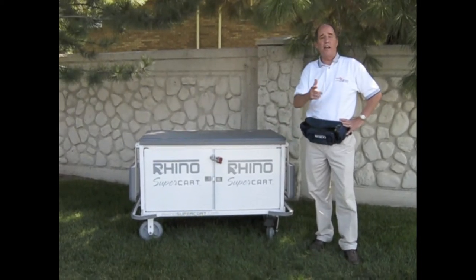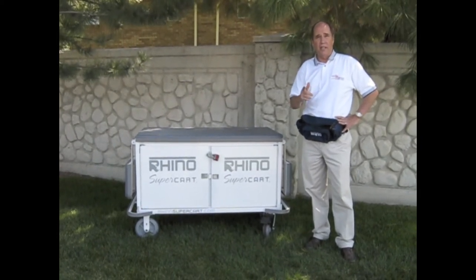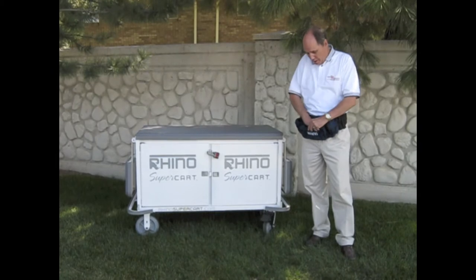The Rhino Super Cart is a great way to keep your emergency equipment secure and close at hand. Let me show you exactly what I mean.